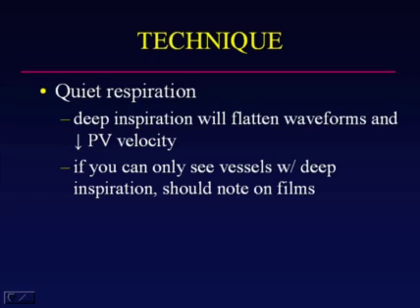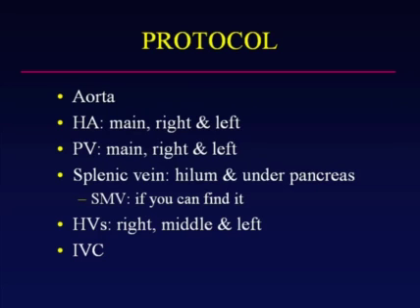So once the patient takes a deep inspiration, the waveforms in the portal and hepatic veins will flatten, the portal vein will increase in diameter, and the portal vein velocity will decrease. So if you can only see these vessels during deep inspiration, you should note this or annotate this on the films. Our protocol includes the following.